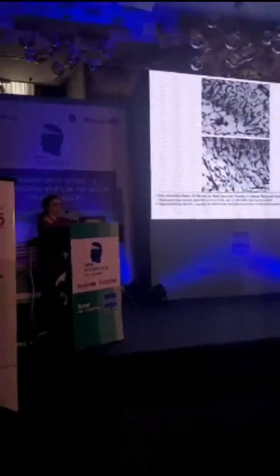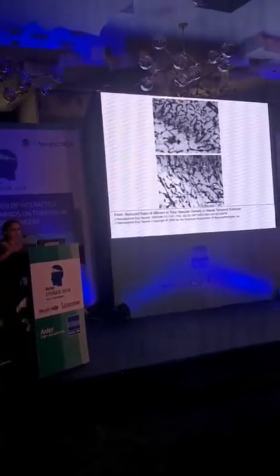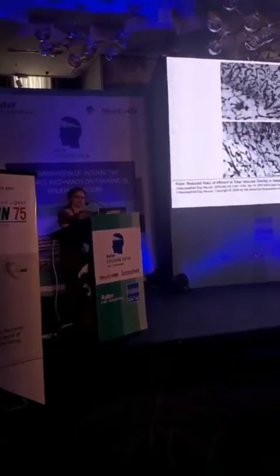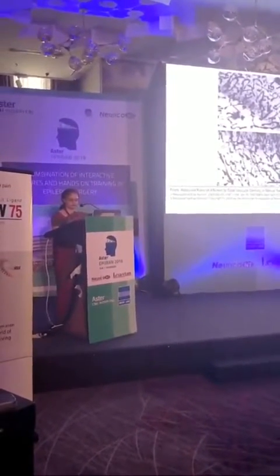Of course, most of you here are surgeons, so there is also this fancy stain which has looked at the number of blood vessels in the hippocampus. What you're looking at on top is a normal hippocampus, versus what you're looking at below, where you see the arrows, you can see that most of those vessels have become really thin. So people believe that there is a regression of the vessels, which contributes to hypoperfusion and a sclerotic hippocampus.